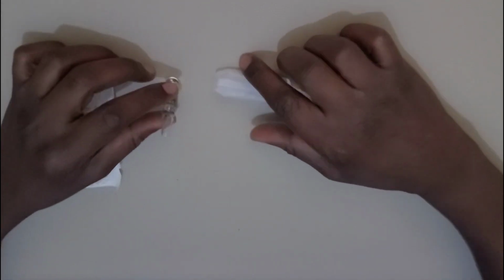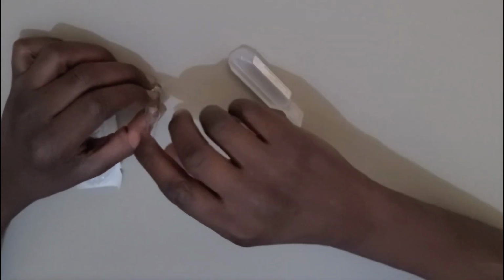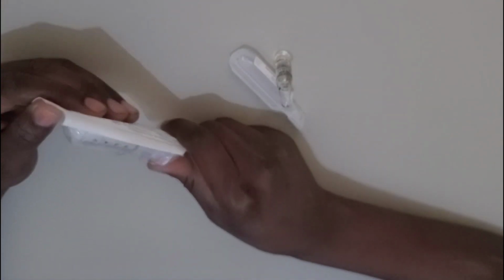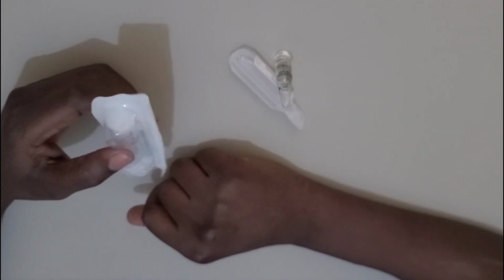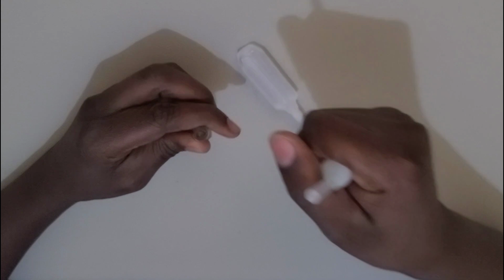So the requirements that are needed are water for injection, the drug itself, and a 10 mL syringe. Now, if we consider economy also, we dilute with 6 mL to make 8 mL. So here is the medication.